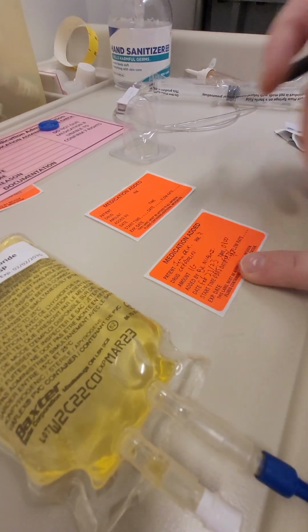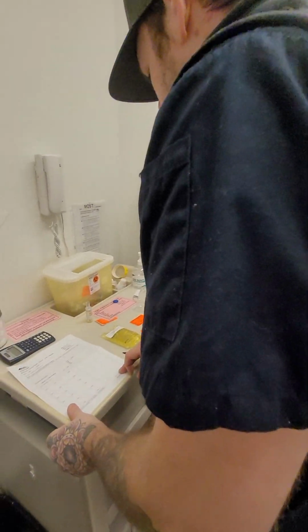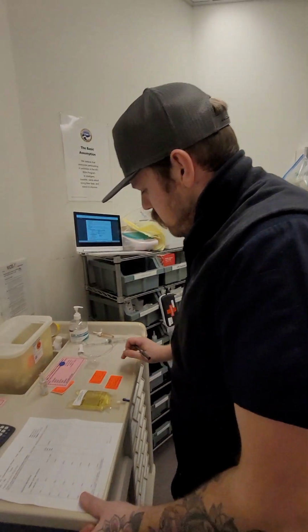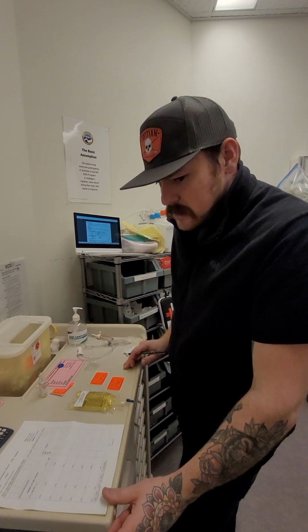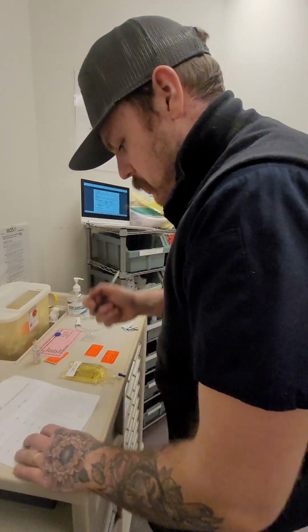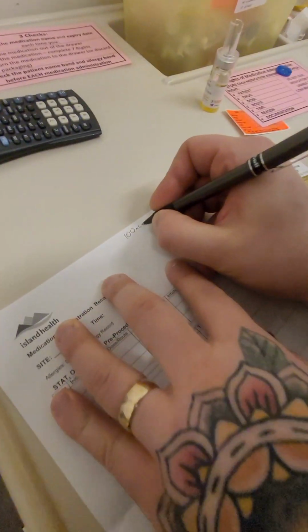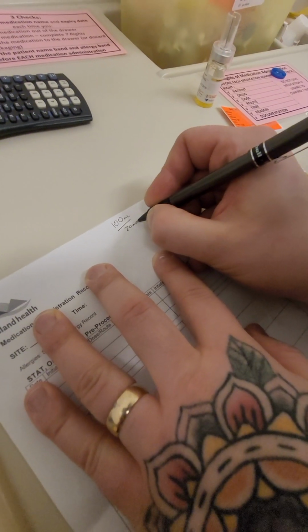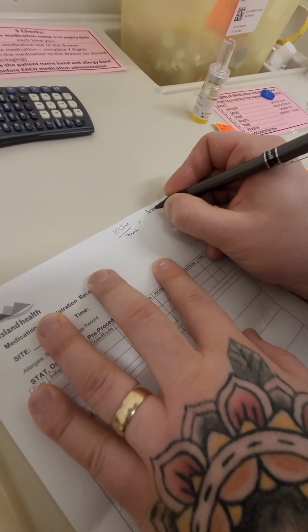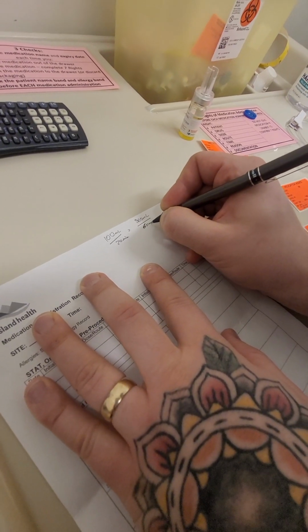Okay, now we got our flow rate here. So let's go ahead and calculate that. So I see on my order that we're going to be giving 100 milliliters over 20 minutes. So let's go ahead and do some math on that. I'm just going to use a blank piece of paper here. So 100 mils over 20 minutes is equal to 300 mils over an hour. So that's what we're going to use to calculate our drip rate.